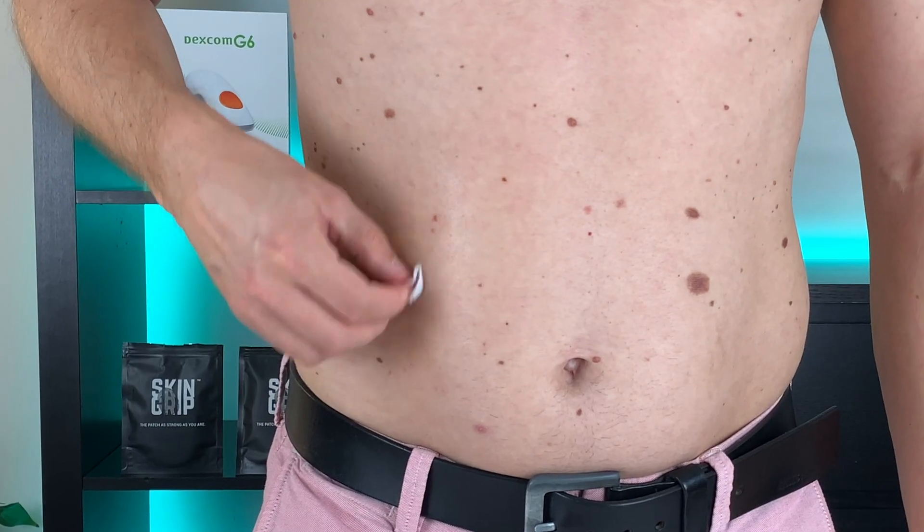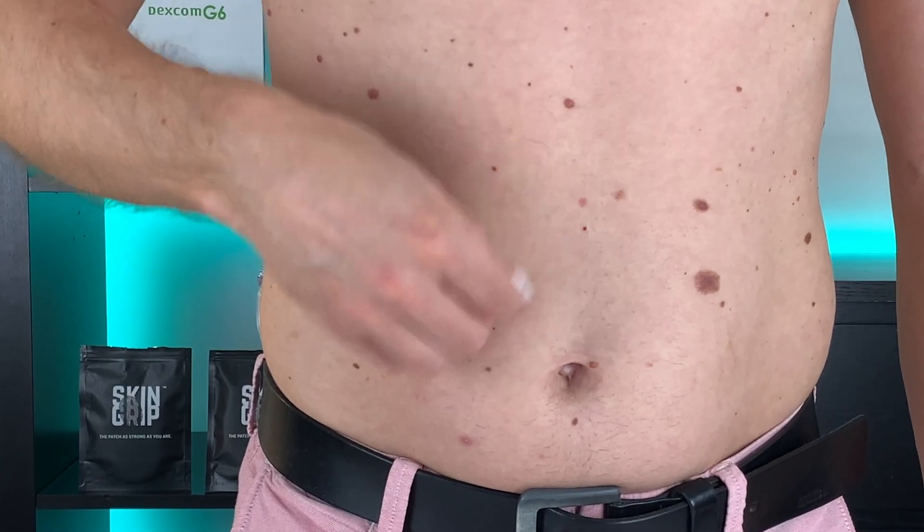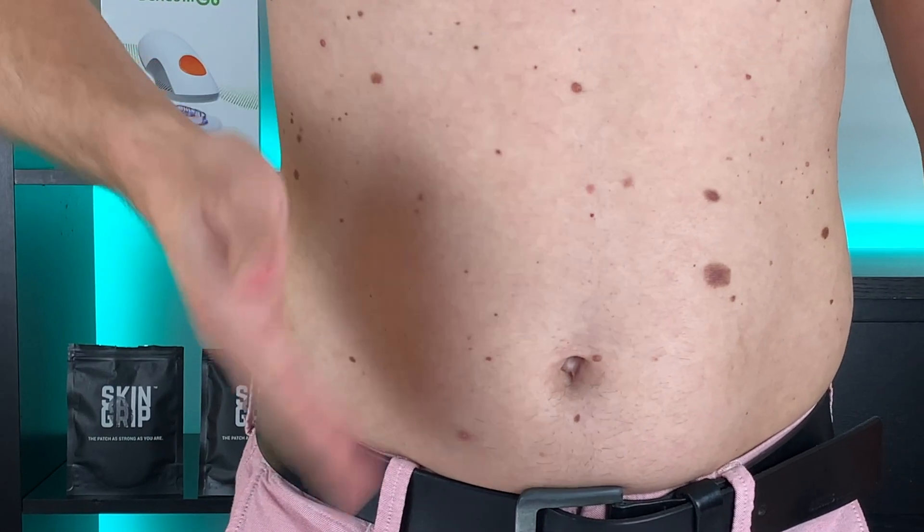Step three: clean the spot you picked with an alcohol wipe. I always try to clean it really well and let it completely dry off. This step is so basic but really important, because the alcohol removes any remaining oily elements from your skin and the adhesive will stick so much better. Get a big box of these because you will not find any in the original sensor pack.